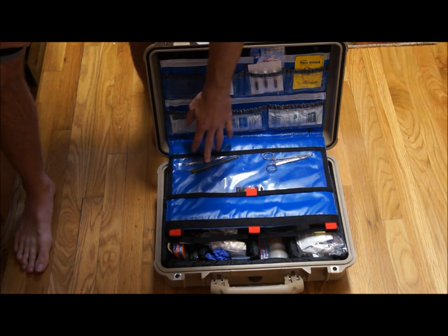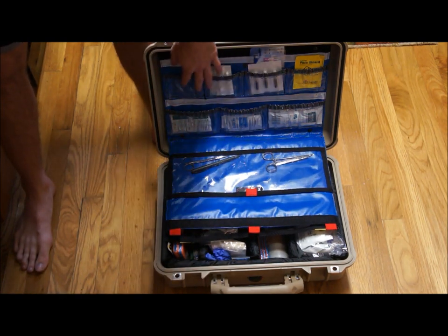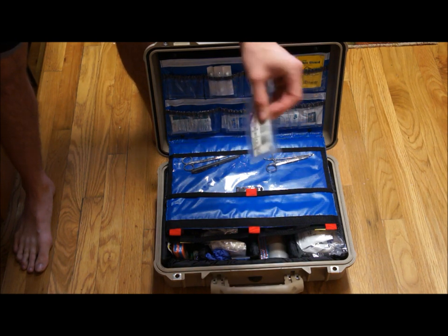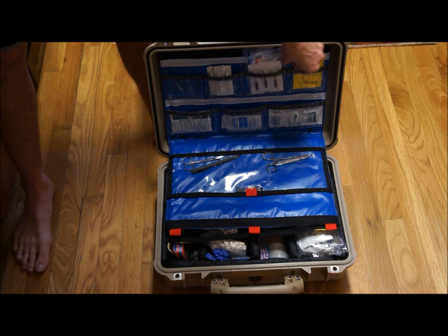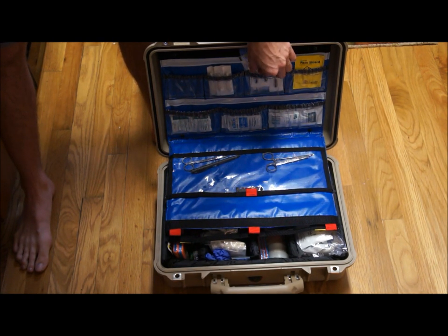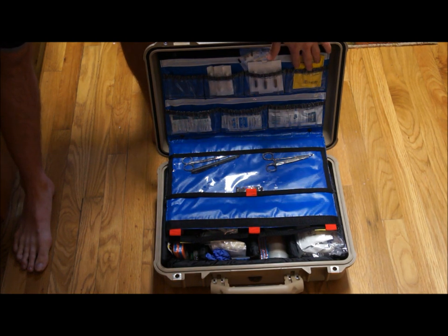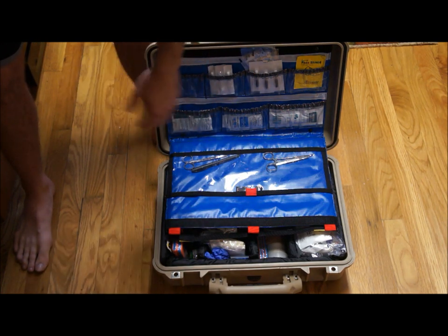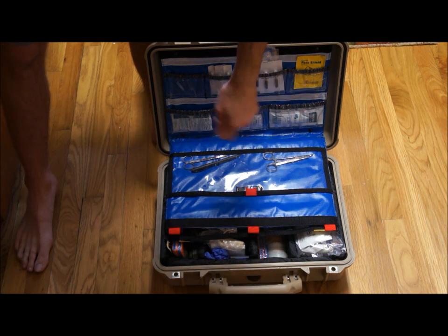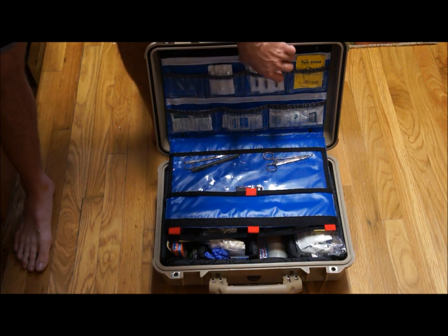I've got some scissors, tweezers, hemostats, a Fisher Space Pen, and some extra stuff. I've got some SteriStrips — these are the strips that, like if you go to the doctor with a laceration on your forehead and they tape it back together, this is what they use. And these brown tubes are benzoin tincture — you apply that to the skin first and then put the tape down, and it allows the tape to stick really well. This is a face shield for CPR. Hibiclens — this is kind of like dish soap, so if you have road rash and need to clean it out, you mix that with water and scrub it. Some burn gel and some moist toilets. That's all I've got in here.